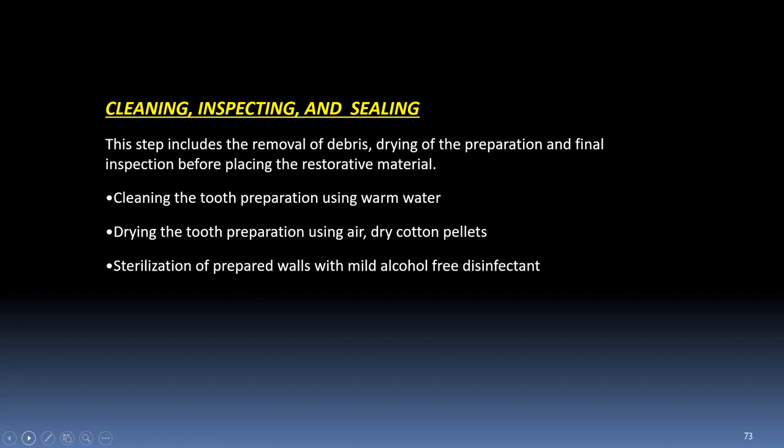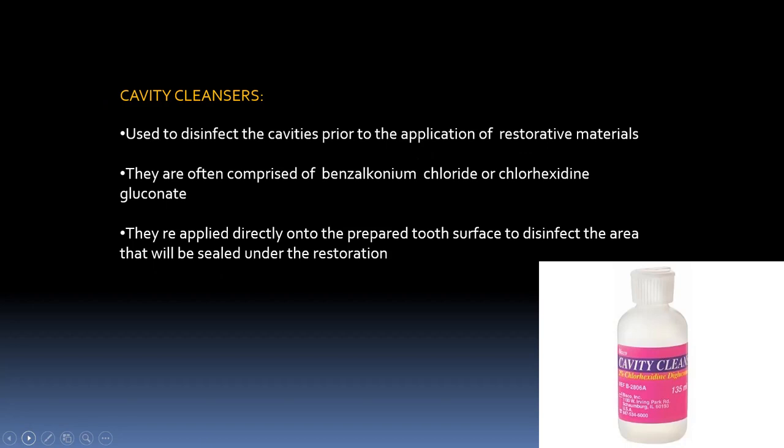And the sterilization of the prepared walls with mild alcohol-free disinfectant. Cavity cleansers can be used for the cleaning of the cavity. They will disinfect the cavity prior to the application of the restorative material. They are usually benzalkonium chloride or chlorhexidine gluconate products, and they can be applied directly onto the prepared tooth surface to disinfect the area that will be sealed under the restoration.